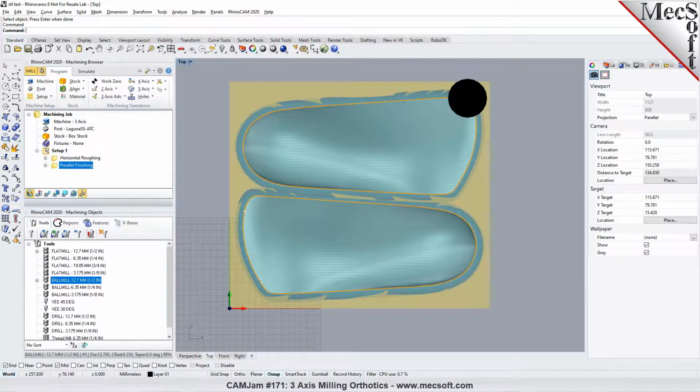So ideally, we would want to mill, let's say, multiple parts per run. We would be able to save multiple jobs and run them at the same time?